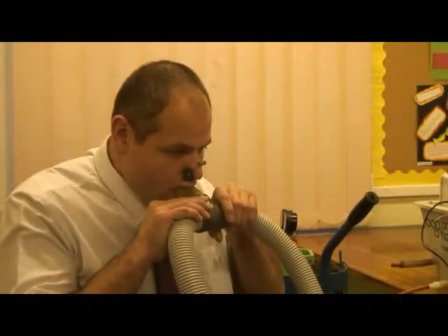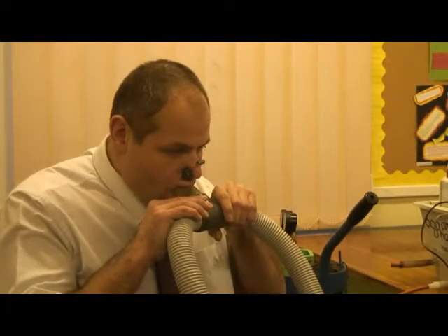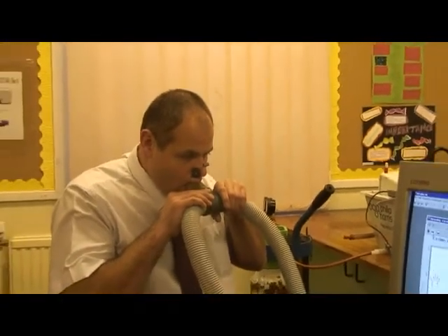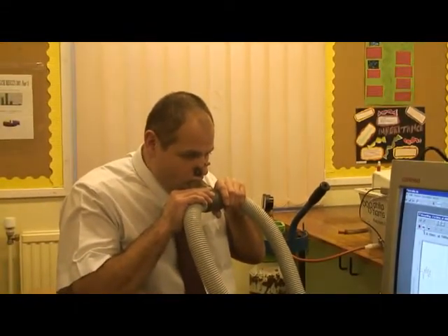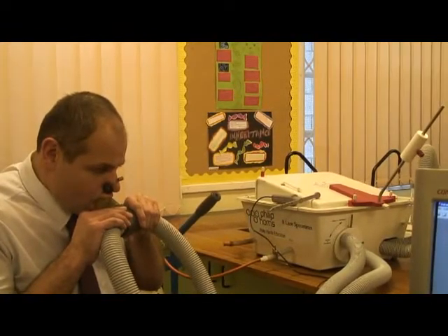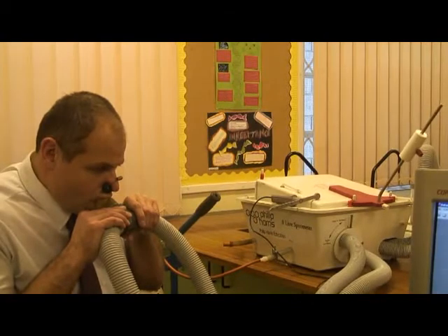We will now move into a sequence where the spirometer is attached to a different subject who is going to breathe in and out normally and then deeply. Notice that the subject has the nose clipped so breathing in and out can't occur through the nose — it only occurs through the mouth.